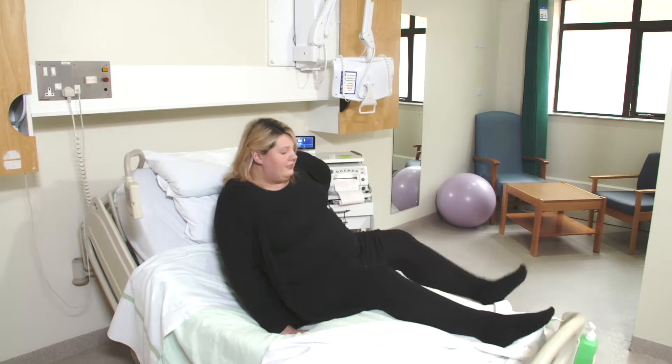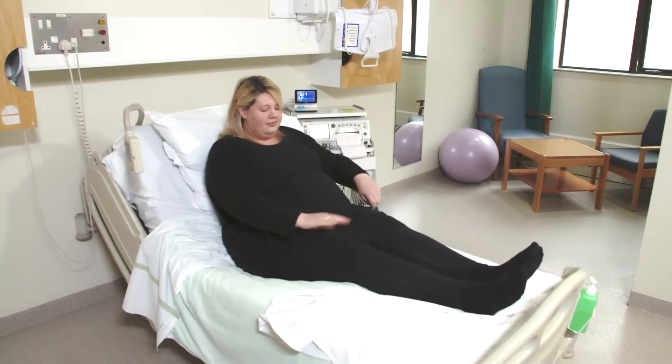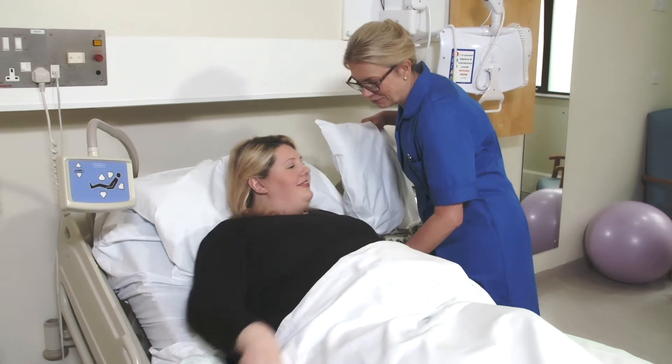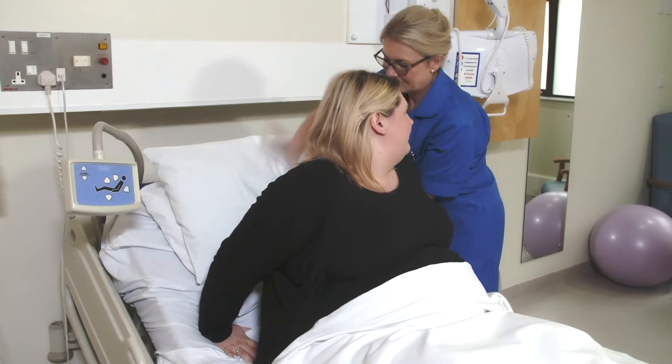The solution is to get the mom back into bed, or use an abdominal binder or maternity belt to support a pannus during upright position or ambulation. If the mom's position is uncomfortable, using a pillow to support the back and head can help, as can asking the mom to lie to the left or right if possible.